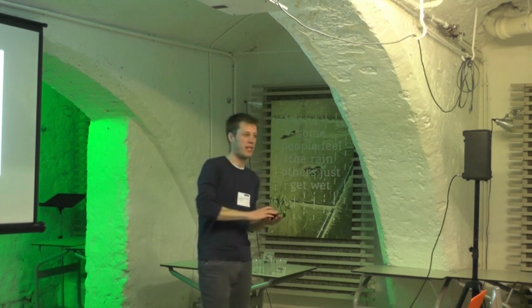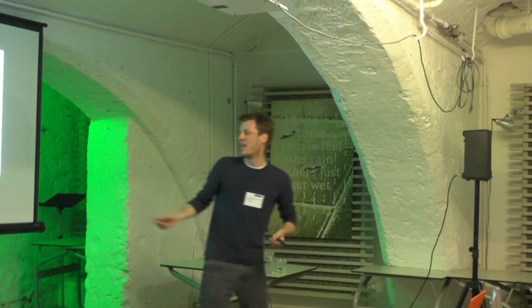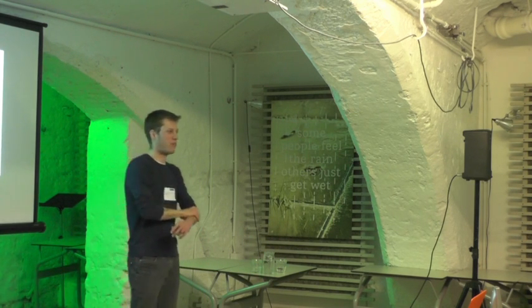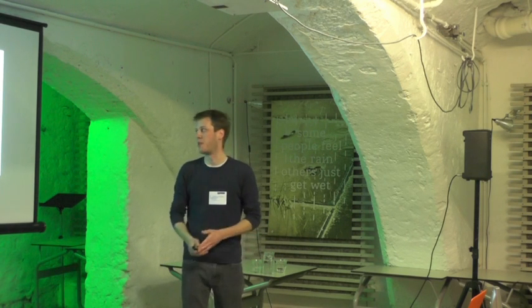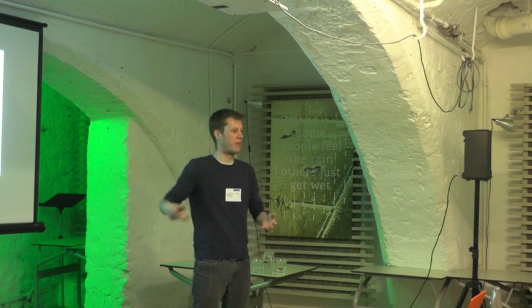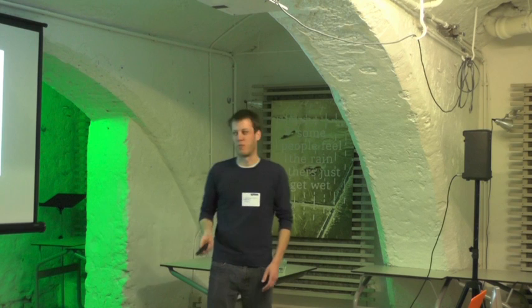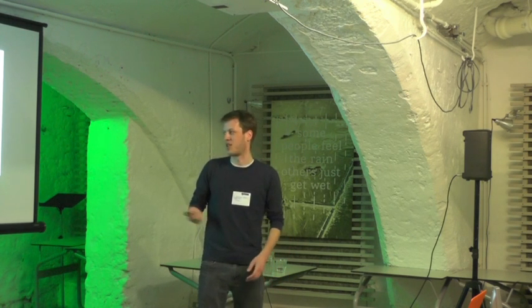And in this glove, we made sensors to sense the world around you. And in the socket, spread out all over the limb, we just put as many vibration motors as we could. Because if you can sense a lot and you can feed back a lot, then you can start looking for what people will recognize, what's good to use, and start going from there.